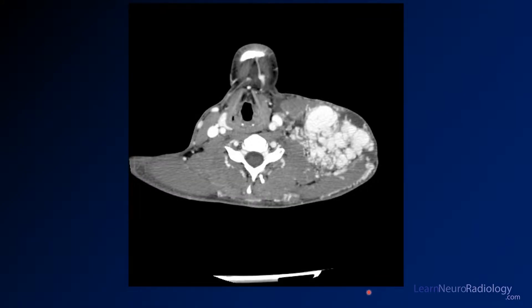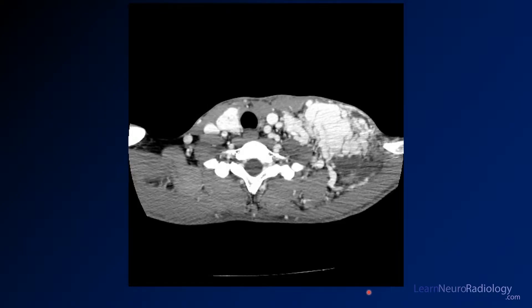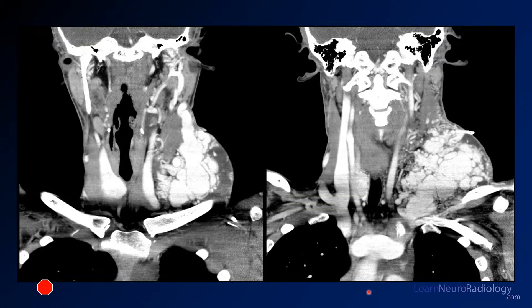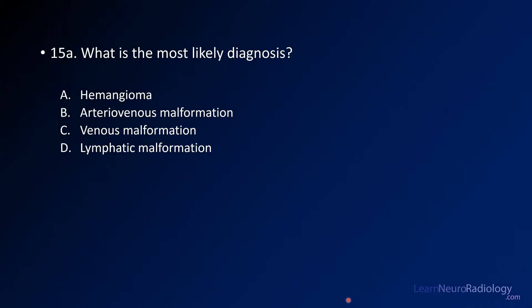I'm going to show you a couple more images from this study. These are coronal images from the same study, just a reconstruction here. Again, you see that palpable abnormality marker there. So your question is: what is the most likely diagnosis?